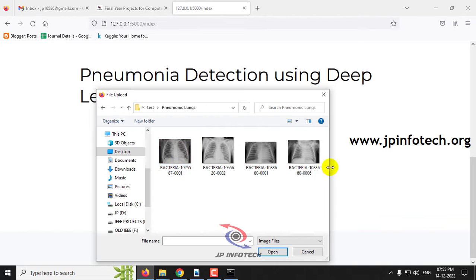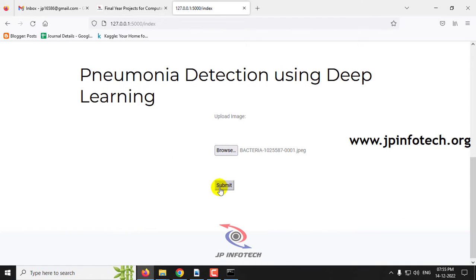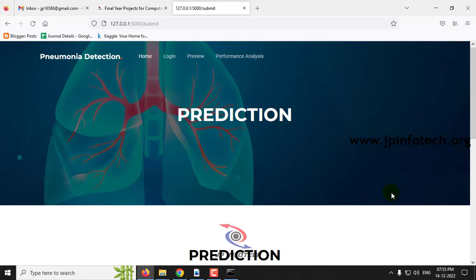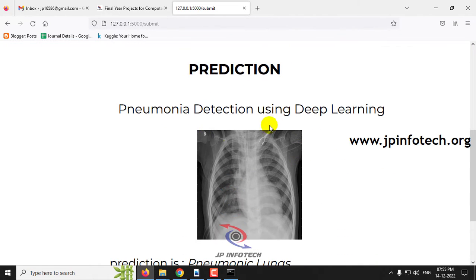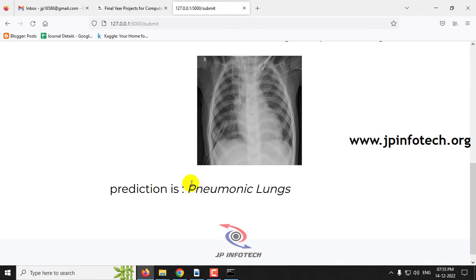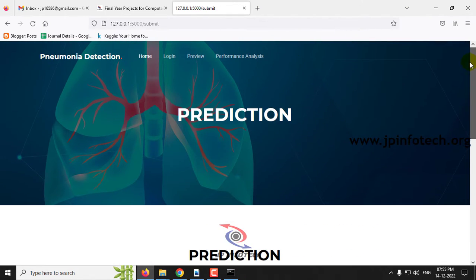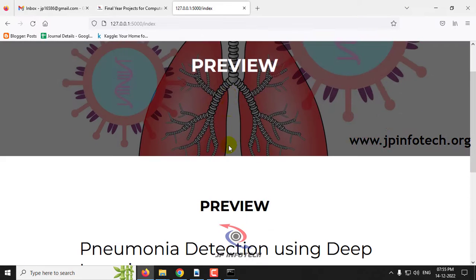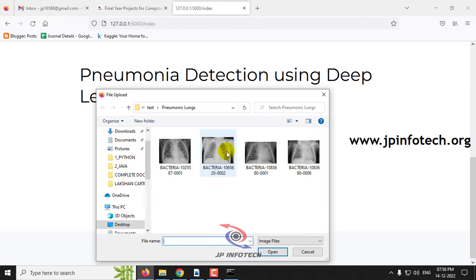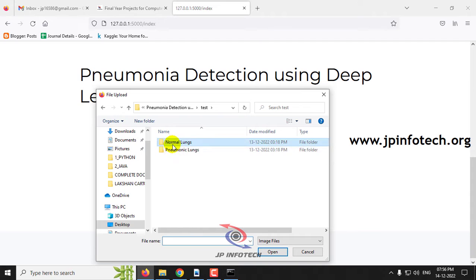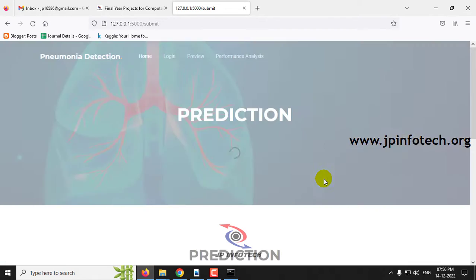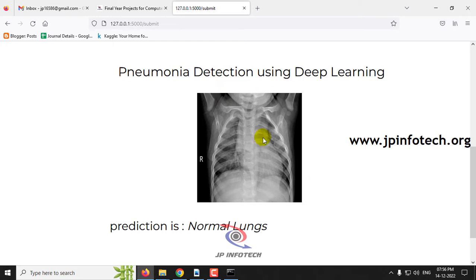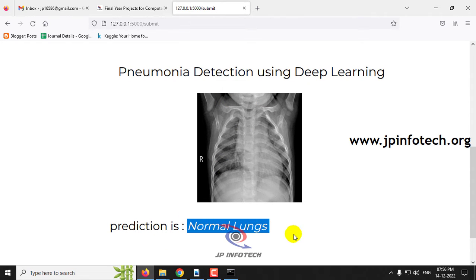Once login is successful, you will see a login success message — click OK. It will navigate to the preview page where you need to enter test images to predict whether pneumonia is detected or not. Click the Browse button, go to the test folder, select an image, and click Submit. You can see the uploaded preview image and the prediction result — for example, 'Pneumonia Lungs' or 'Normal Lungs' depending on the image selected.